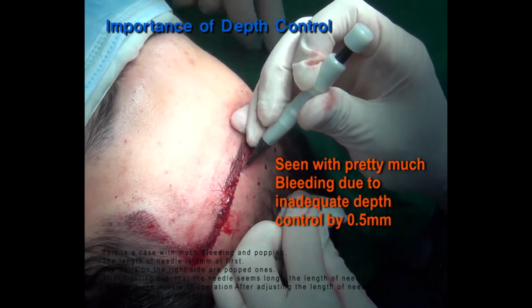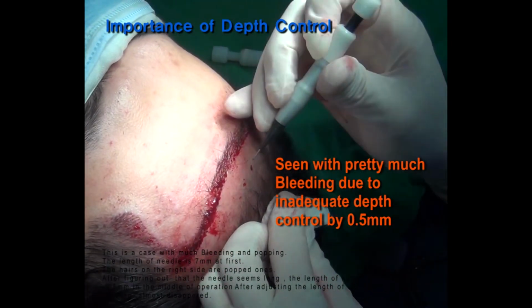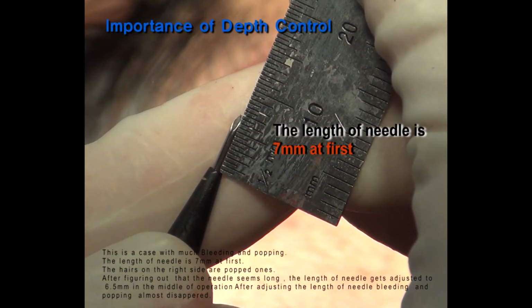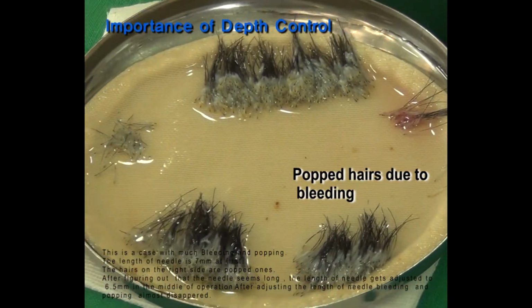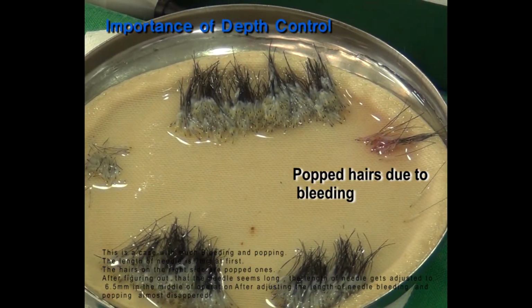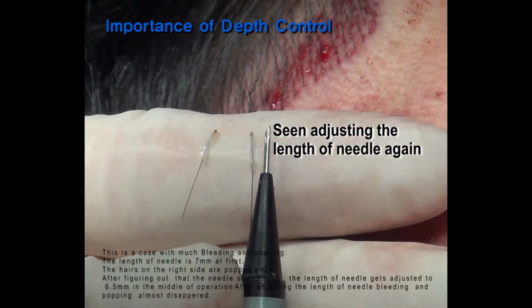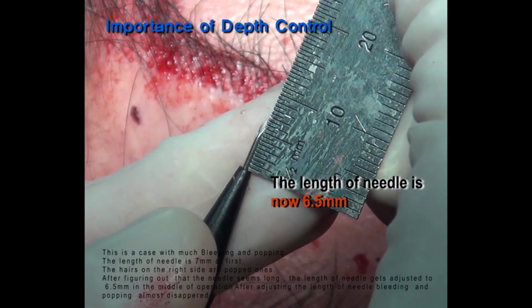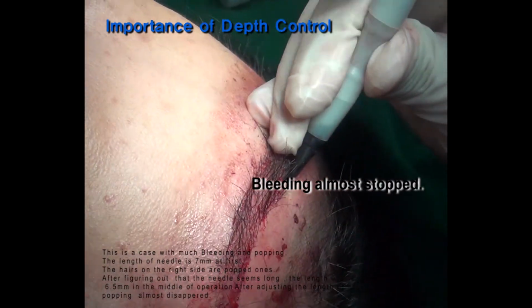This is a case with much bleeding and popping. The length of the needle is 7 mm at first. The hairs on the right side are popped ones. After figuring out that the needle seems long, the length of the needle is adjusted to 6.5 mm in the middle of the operation. After adjusting the length of the needle, bleeding and popping almost disappeared.